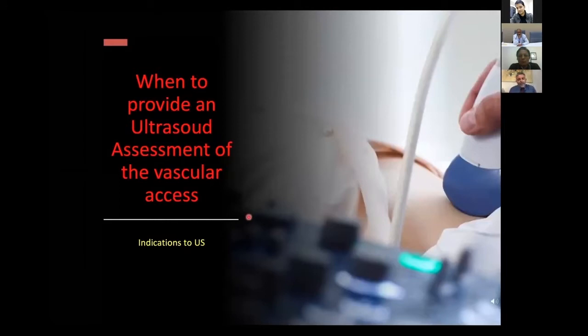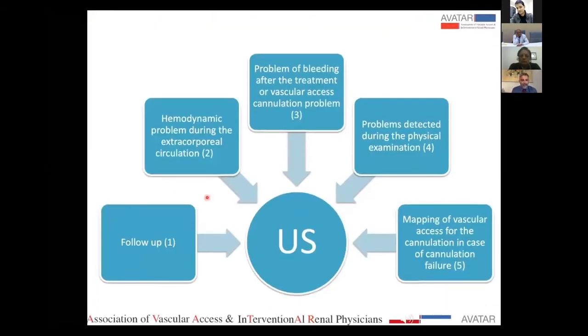First of all, it is necessary to identify the clinical situations in which it is necessary to perform an ultrasound examination to better manage the resources available. We have to identify some indications according to our clinical practice and our reality. So we can have a protocol for the general follow-up of our patients.